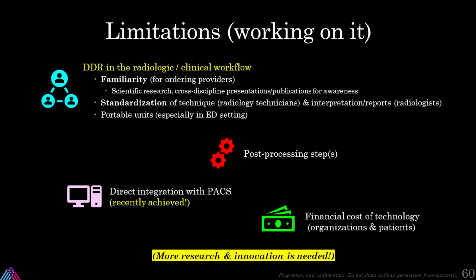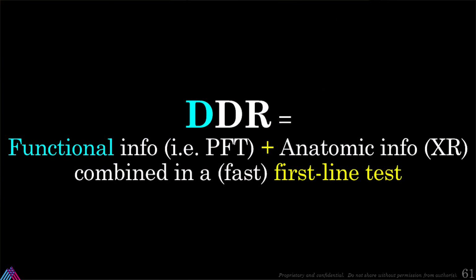Right now it is FDA approved, kind of as a cine loop for radiography. So just to emphasize that more research and innovation is necessary in dynamic digital radiography and in radiography in general. And to reemphasize that all that we've discussed today is that it's functional information and anatomic information in a first-line test.